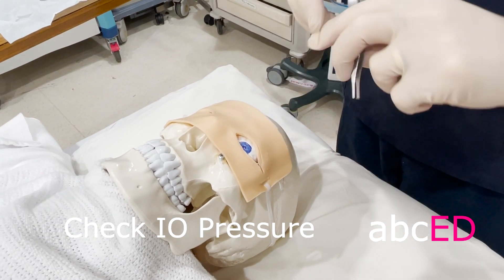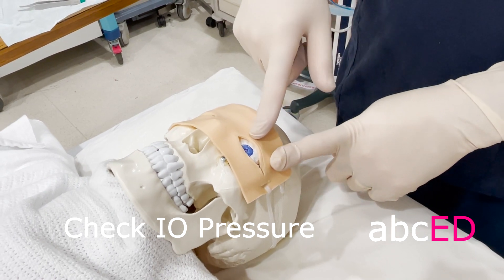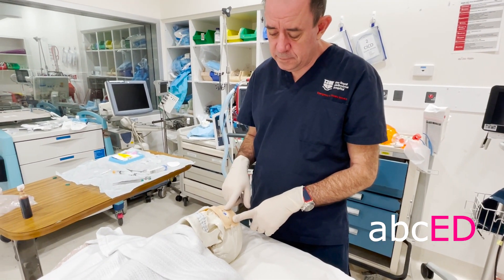Re-measure the pressure — you'd be surprised how quickly it comes down. You should re-measure the pressure within 15 minutes; at 15 minutes the pressure should be down below the danger level.